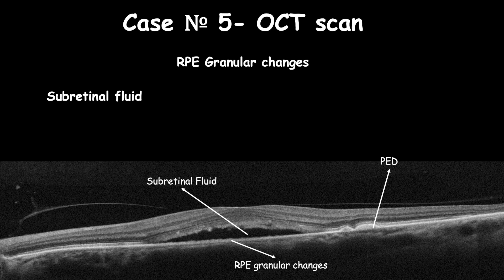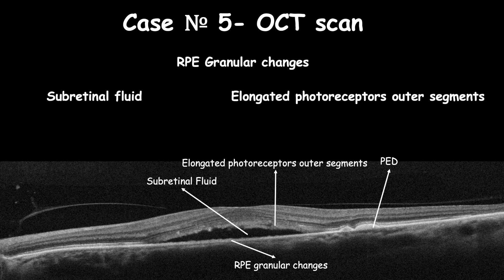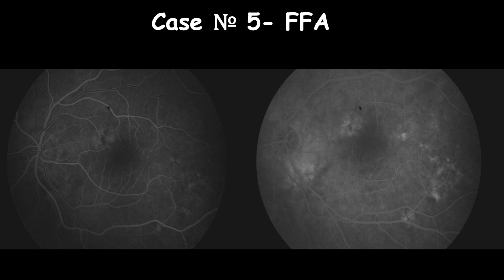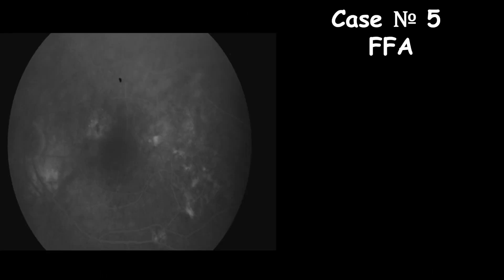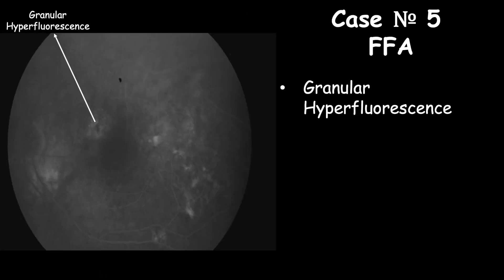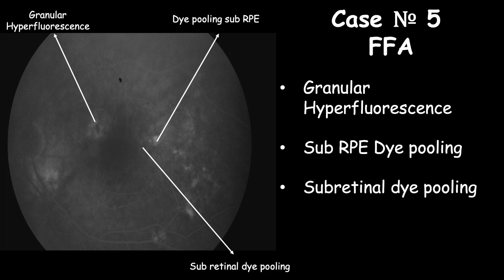There is also elongation of photoreceptor cells and increased thickness of the choroid. Fluorescein angiogram in early phase shows hyperfluorescence from granular RPE changes, which increases and becomes more prominent in the mid-phase with hyperfluorescence from PED. In late phase, there is granular hyperfluorescence with sub-RPE and subretinal pooling. The diagnosis is chronic central serous retinopathy.